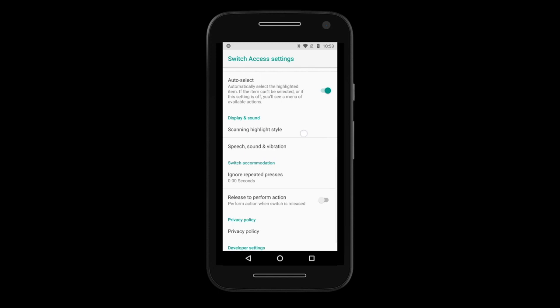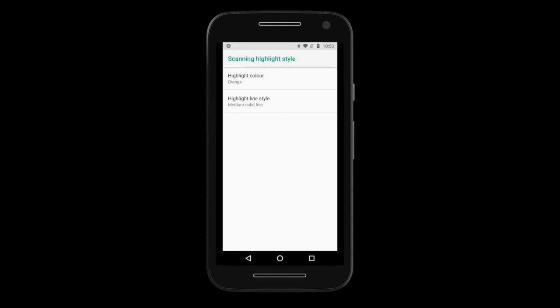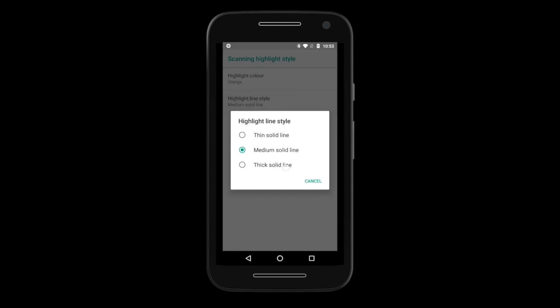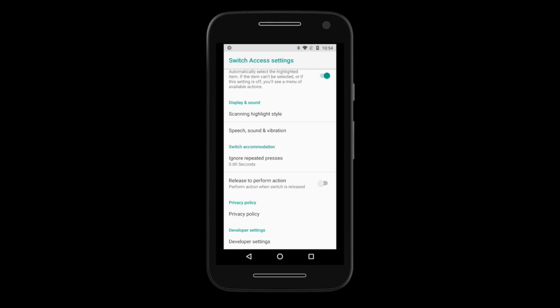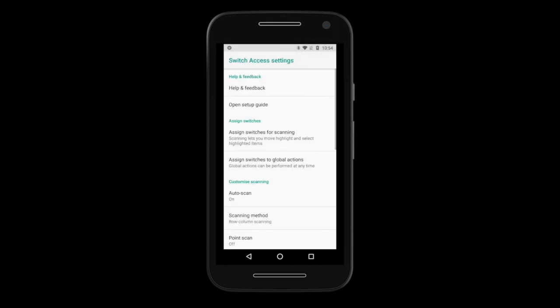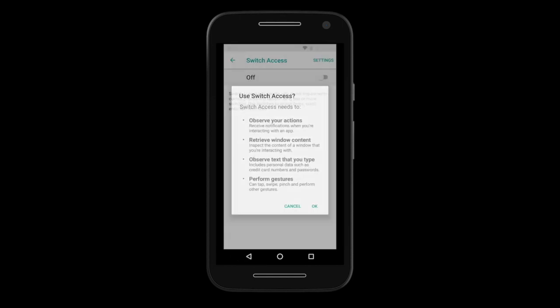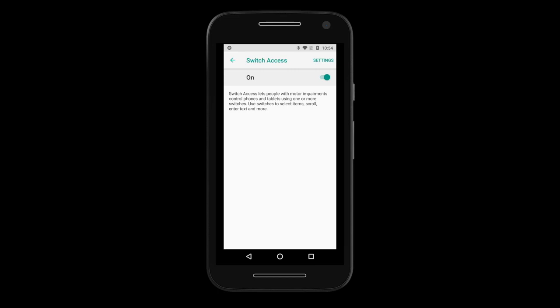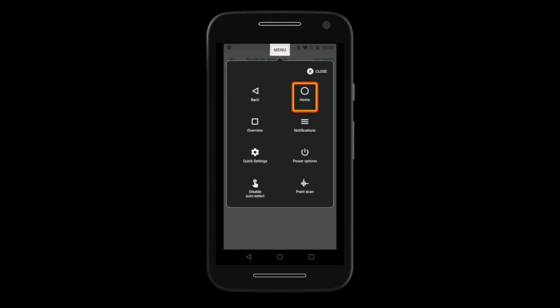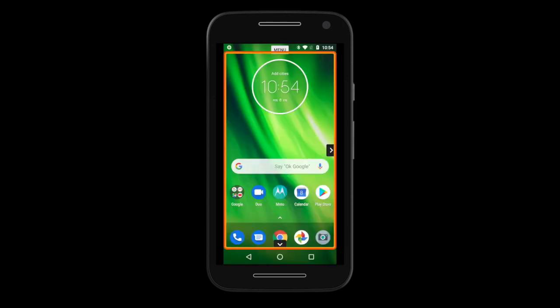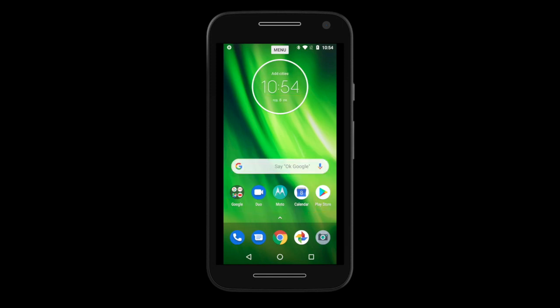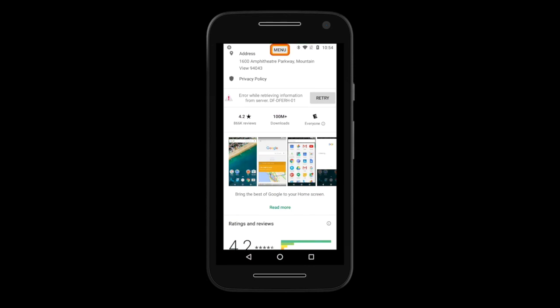Next, Scanning Highlight Style — here you can customize how the interface looks. We usually change the color and thickness so it will be easier to see and follow. Once you activate Switch Access on the main page, you will see a menu button at the top of the screen and elements of the screen will be scanned at the set scanning rate. You can select an item by pressing your switch when the item is highlighted. If you select the menu button, you will have access to the back, home, and overview buttons, as well as notifications, quick settings area, and power options.